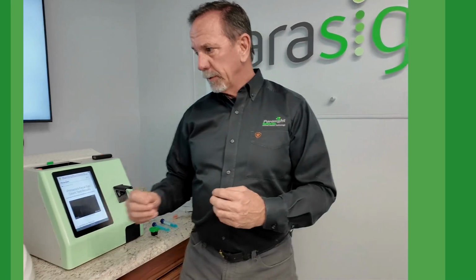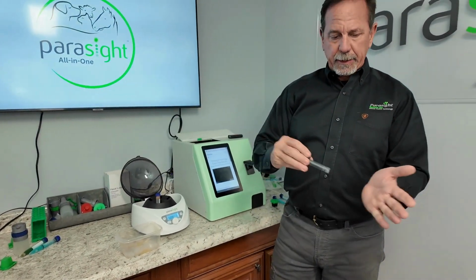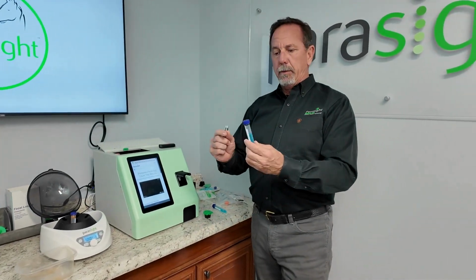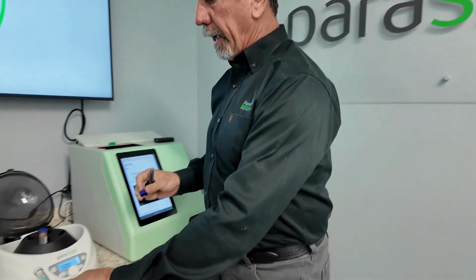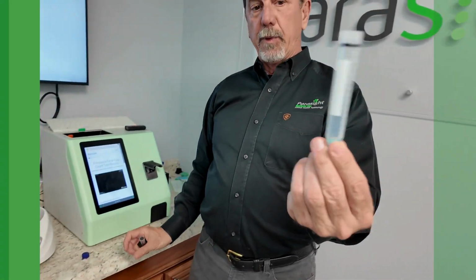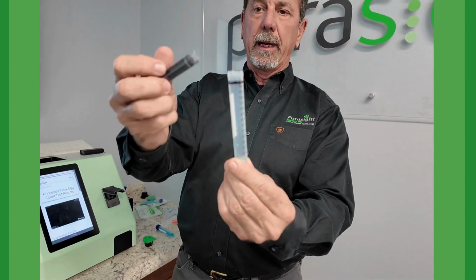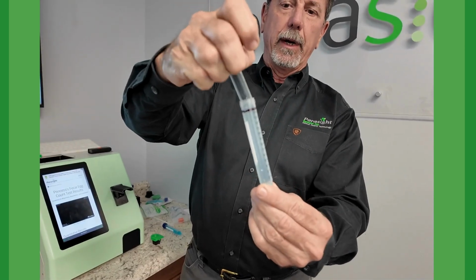So the first thing that you will do is take the sample like you would normally do. You get the 1 gram sample, and you'll take one of these tubes, and you're going to pour off the liquid that's normally in there, leaving the ball at the bottom. You'll take the fatty fecal sample and put it in there.